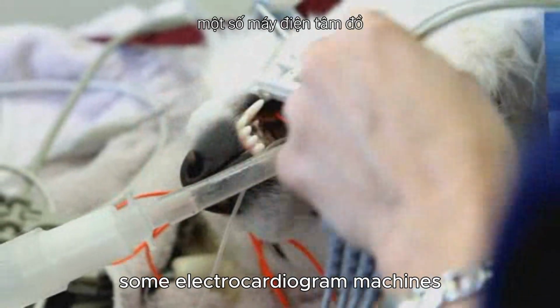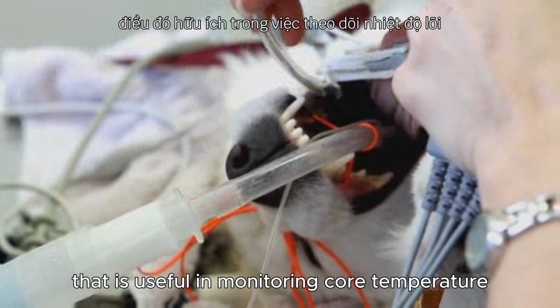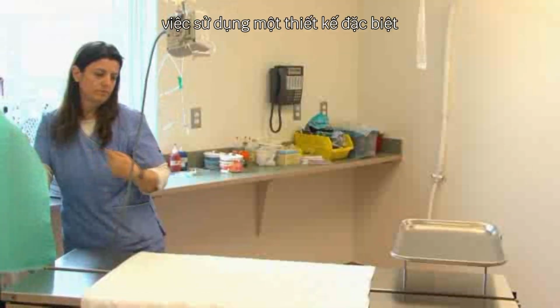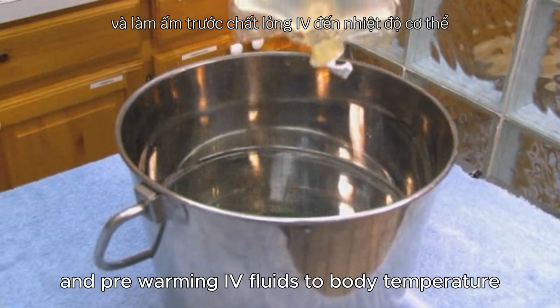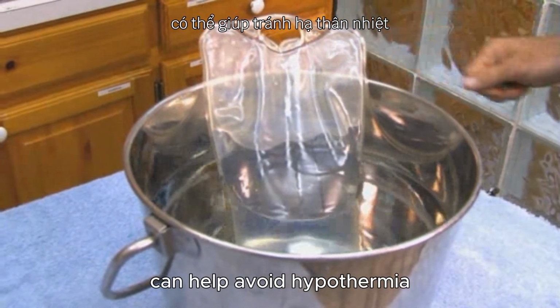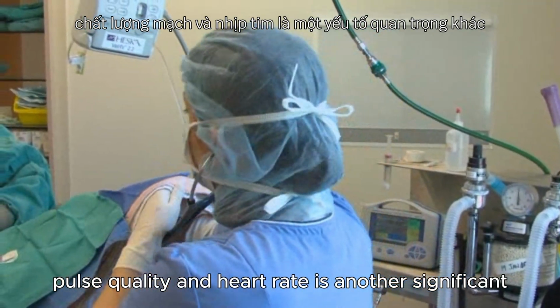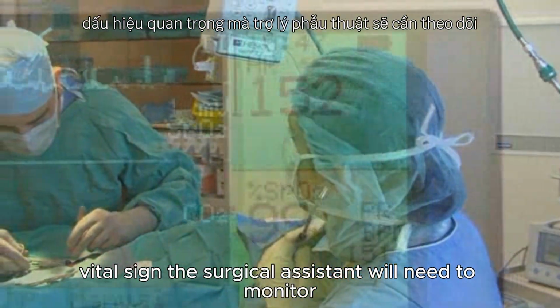Some electrocardiogram machines use an esophageal temperature probe that is useful in monitoring core temperature. The use of a specially designed water circulating heating pad and pre-warming IV fluids to body temperature can help avoid hypothermia. Pulse quality and heart rate is another significant vital sign the surgical assistant will need to monitor.